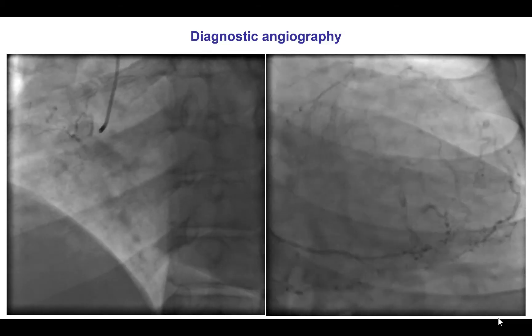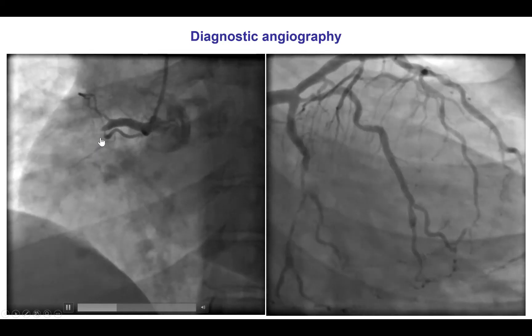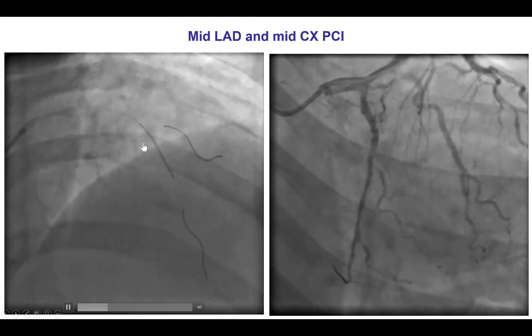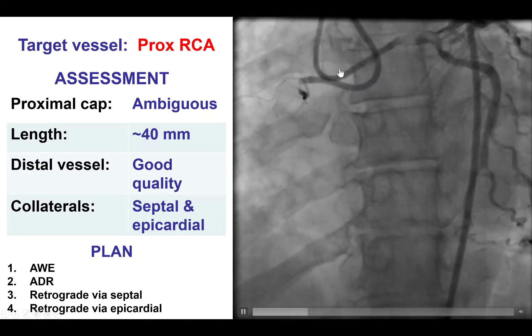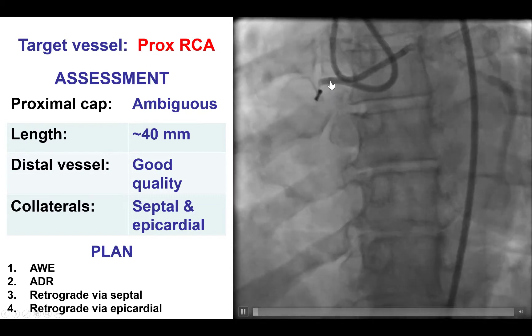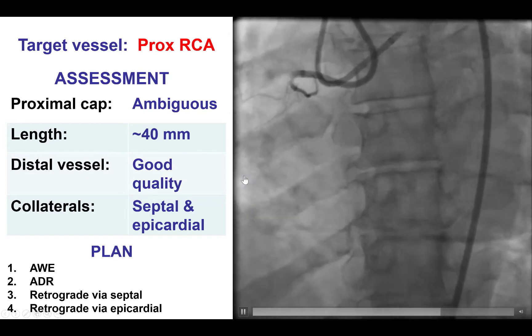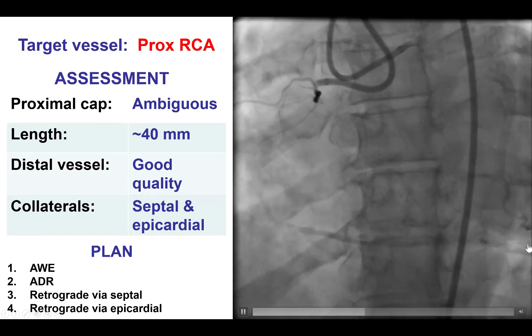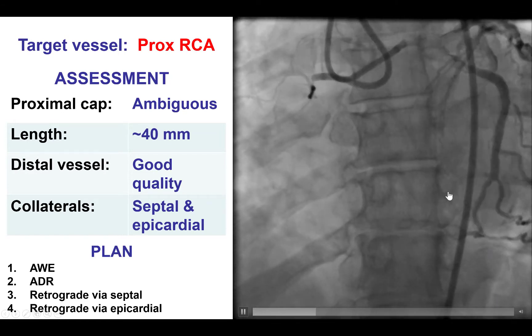These were the images for the initial presentation. She had a CTO of the proximal right coronary artery with a small marginal branch originating at the proximal cap. She also had significant lesions in the circumflex and mid-LAD, which were successfully treated with drug-eluting stent implantation. Dual injection, which is critical for planning CTO-PCI, demonstrated a blunt proximal cap. The occlusion length was approximately 40 millimeters, the distal vessel was of good quality with some disease, and collaterals included an epicardial collateral from the apical LAD and septal collaterals connecting from the LAD to the PDA.